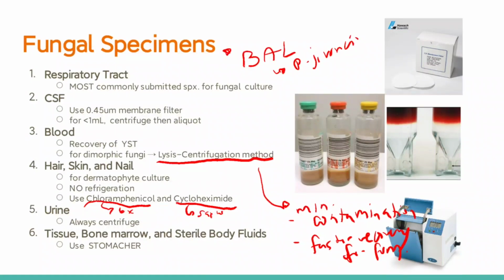So, basically, when you use chloramphenicol, you inhibit bacterial contamination, and when you use cycloheximide, you inhibit saprophytes, including pathogenic yeasts. Okay? So these two, chloramphenicol and cycloheximide, are for dermatophyte recovery.